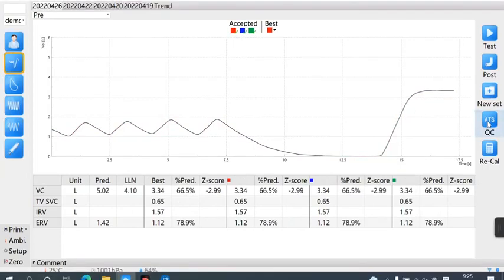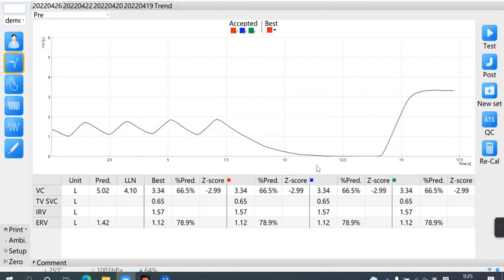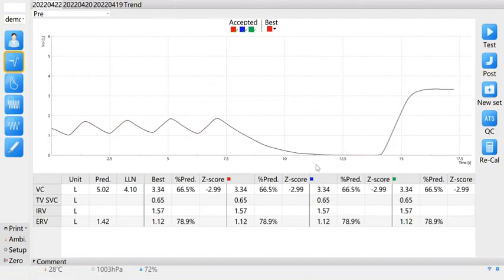Click Quality Control to view the 3 test results. It meets the requirements of normal, stable breathing, complete exhalation, and the platform conditions are acceptable. The test results are reliable.